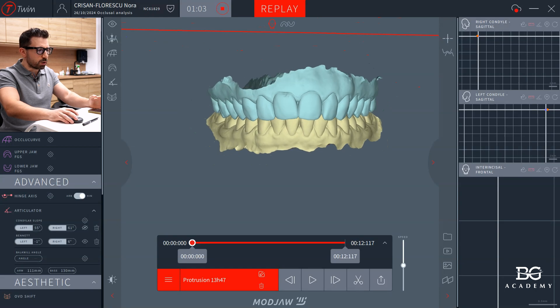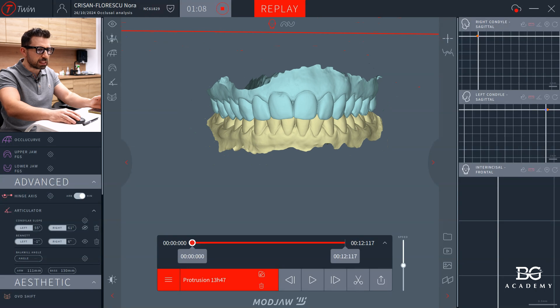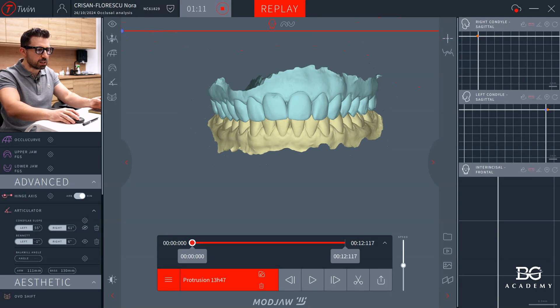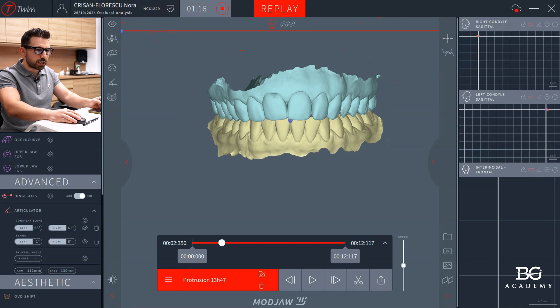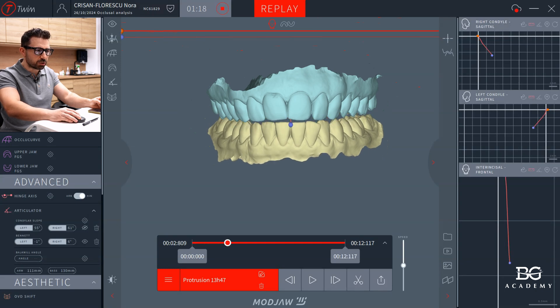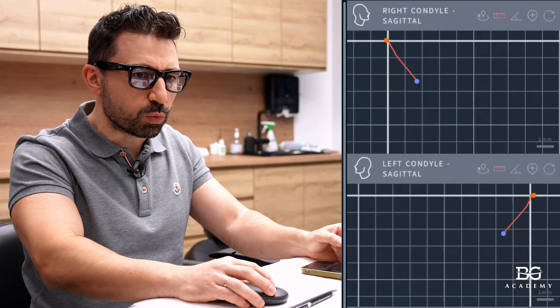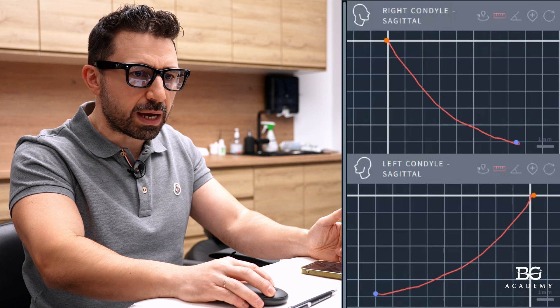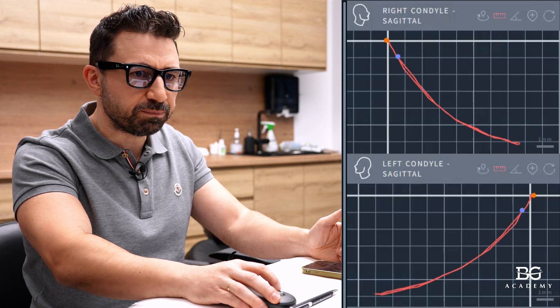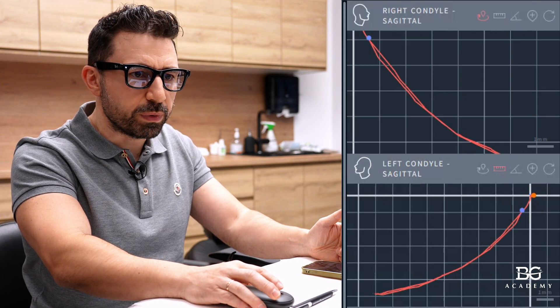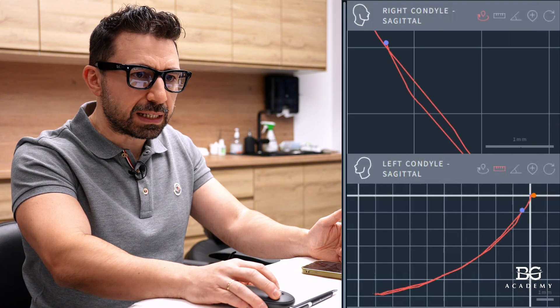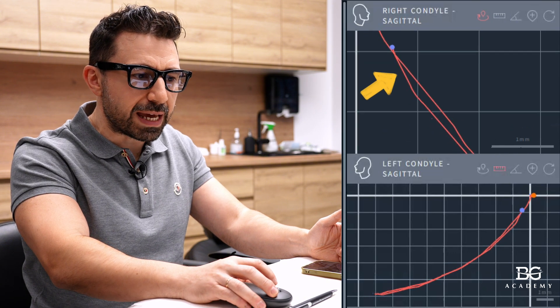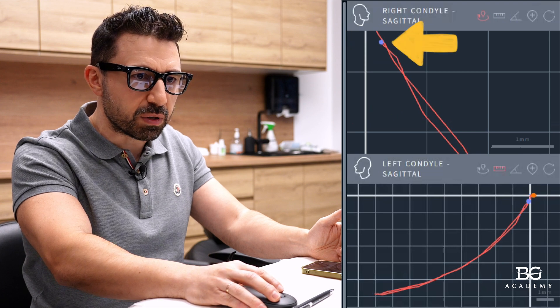We are doing a protrusion movement, and on the tracing here on the right side you will be able to see the click. If I play the movement, I would like you to focus on this area — not the teeth, but this area. We go this way — it's a protrusive track, full amplitude — and when she goes back, in this area, you can see some kind of belly shape, or we call it a figure eight, number eight.